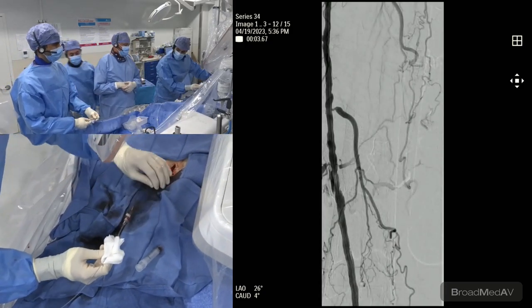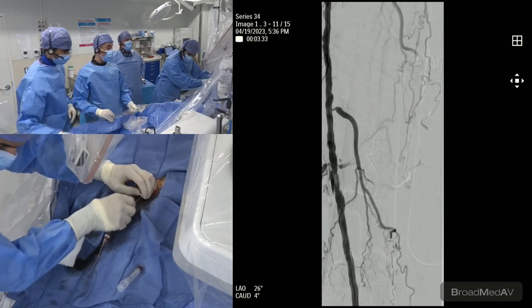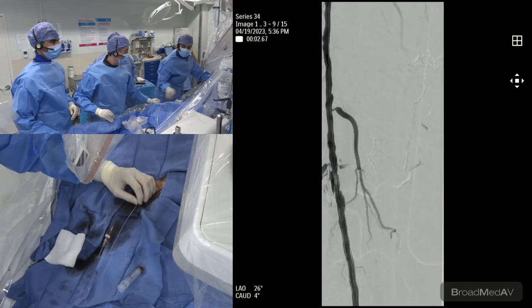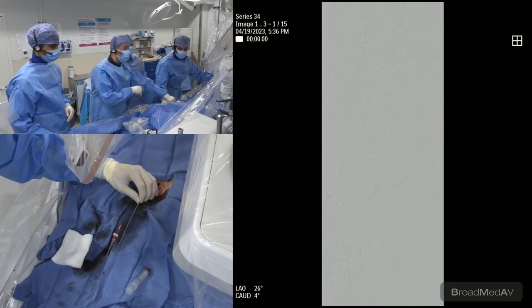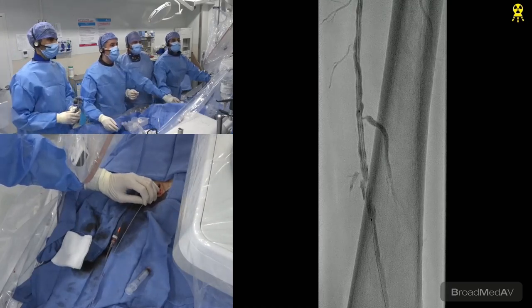So, Robin, I don't think you talked about vessel prep. Yeah. Ray Lozano is the nurse practitioner who was crucial to almost all of our cases. He was one of the first people to tell me, whenever you're going with the Supera and planning on it, just absolutely prep this vessel more than you could ever even think of.